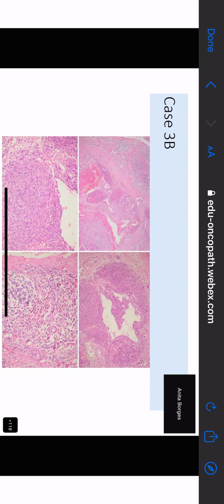Anybody, come on. Ma'am, I thought it is a case of epithelioid hemangioma. Epithelioid hemangioma. Yes, ma'am. Who said epithelioid hemangioma? Ma'am, I said. Who's the I? Ma'am, Dia.